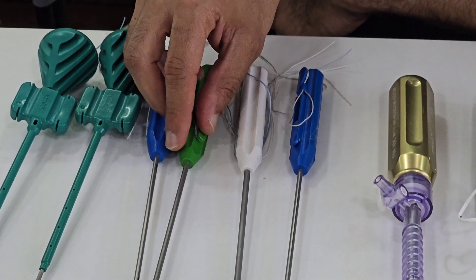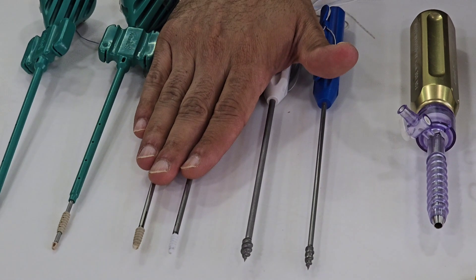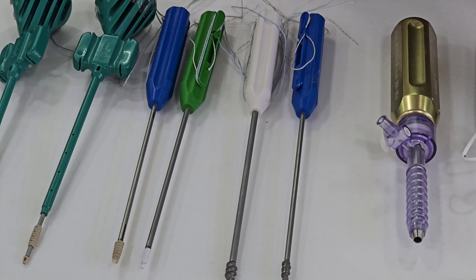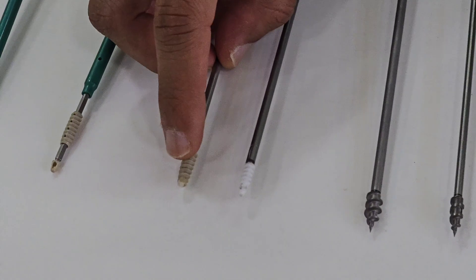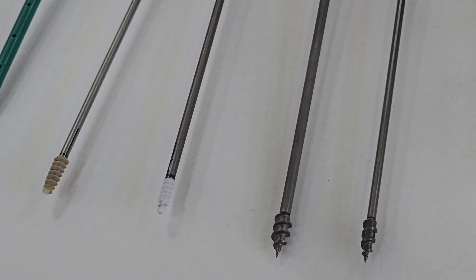We also have options for non-metallic anchors. We have 4.5mm and 5.5mm corkscrew anchors available in both biocomposite and PEEK material. This one is a PEEK material SwiveLock 5.5, and this one is a biocomposite material SwiveLock at 4.5mm. These are the different variations available.